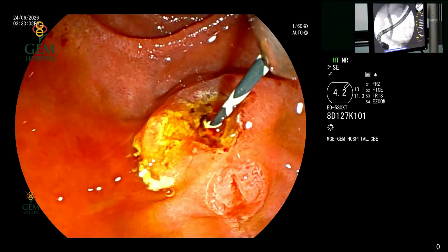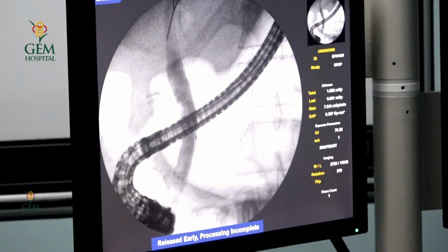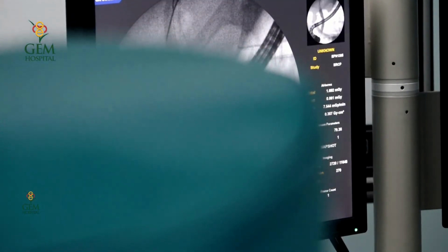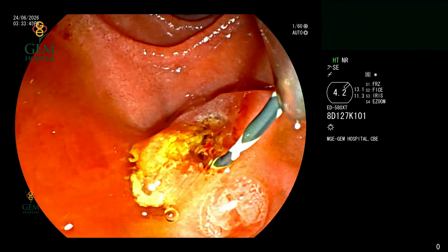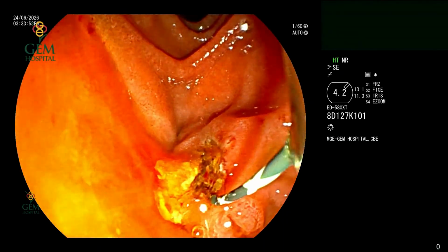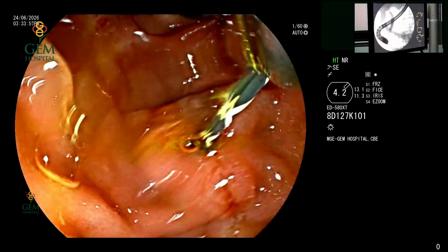If you take a closer look at the cholangiogram, what we are seeing is a dilated biliary system. And if you take a look at the distal tip, the tip that is closer to our scope tip, we can see a smooth tapering. Where you see the CBD is tapering smoothly, we are not noticing any abrupt cutoff. It's a small tapering cutoff with a small possible distal filling defect just above the tip. We hope our camera zooms in and you're having a proper visual of the same.